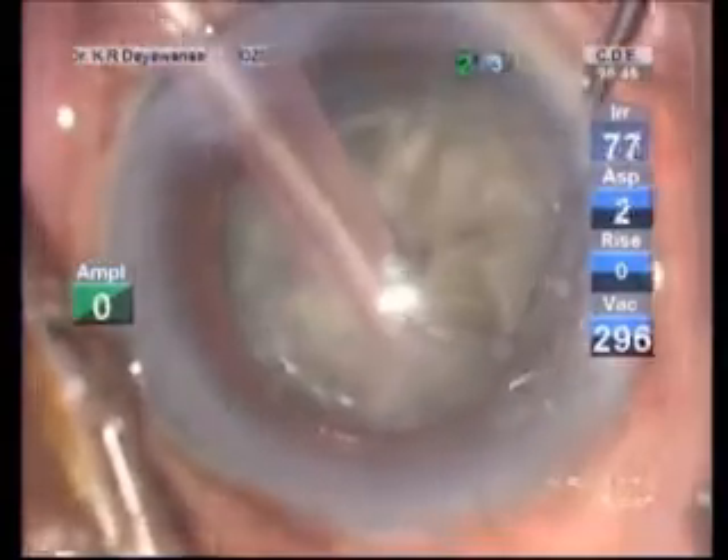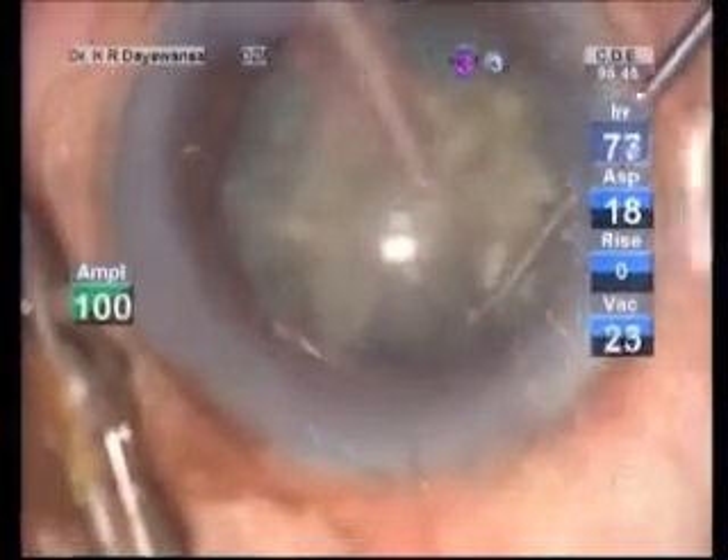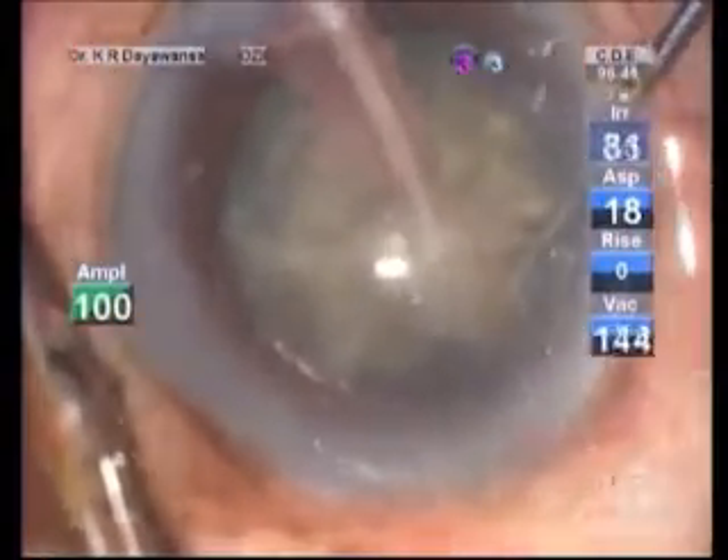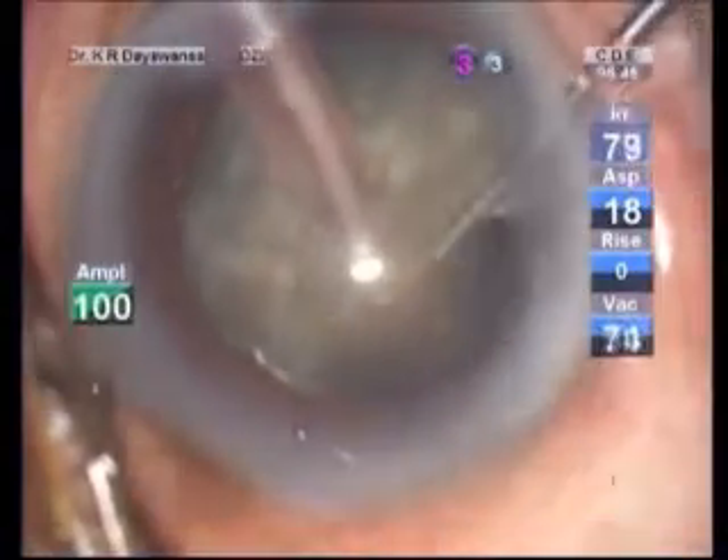Once we are clear of separating all the fragments into clear pieces, it is not difficult to aspirate the fragments using phaco energy. But the surgeon must wait very patiently, because these leathery fibers take time to clear the phaco needle.